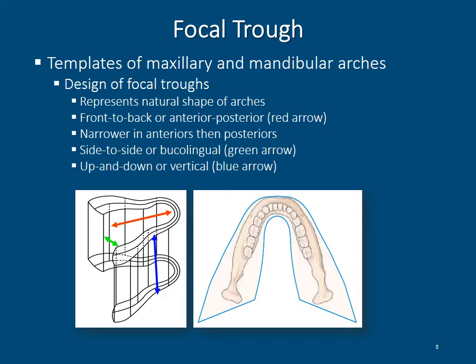Most machines will have up to 4 size selections, and each of these size selections, in response to the patient size, also has its own particular jaw size line. The other thing that calibrates in the machine when you're selecting the type of focal trough for patient size is the amount of radiation each patient will receive.